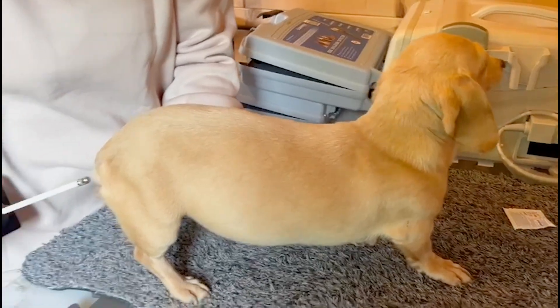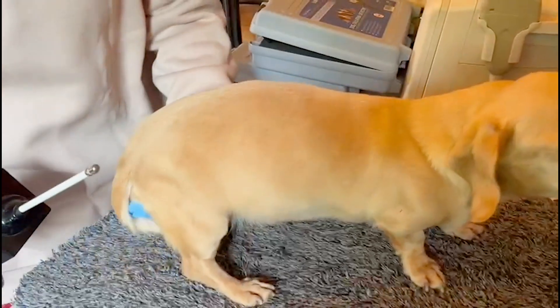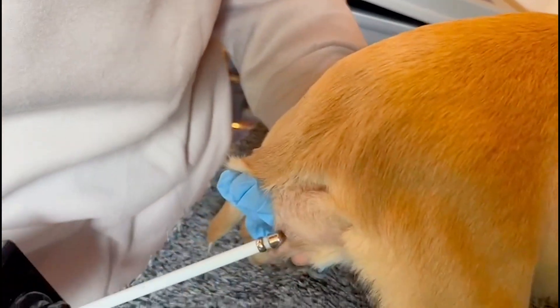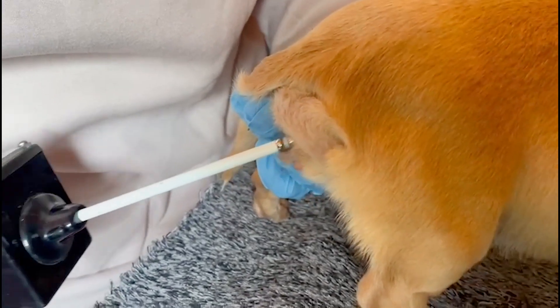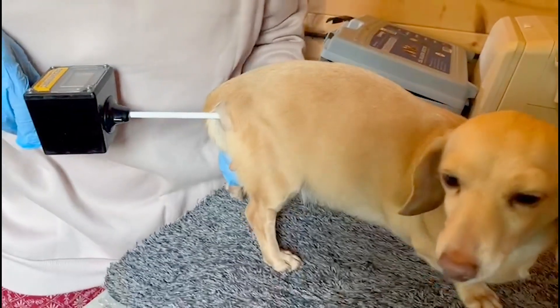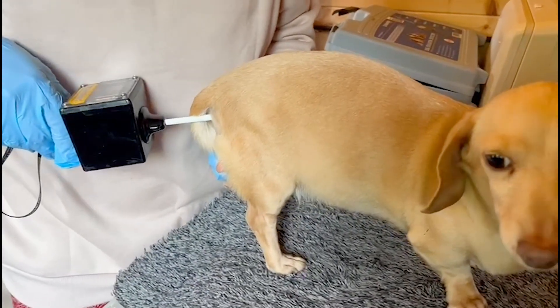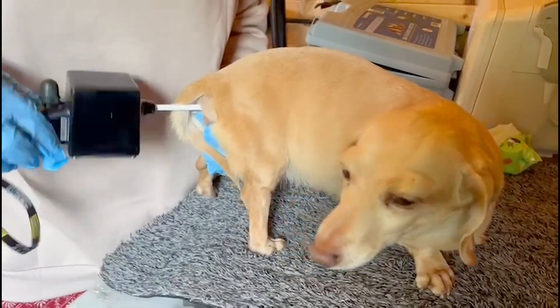You can see that amazingly they all still work and show the same numbers. We insert it at an angle, very carefully — this does not hurt anyone. You insert it and then you pull it up, and then you stop when you feel some resistance, then you roll it.